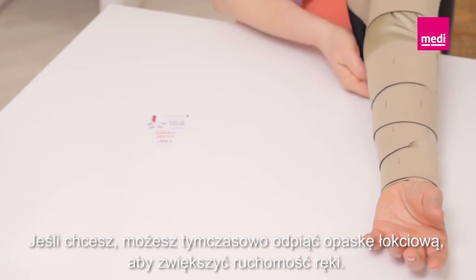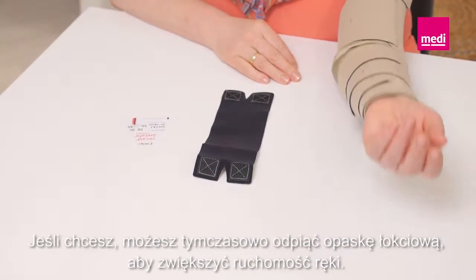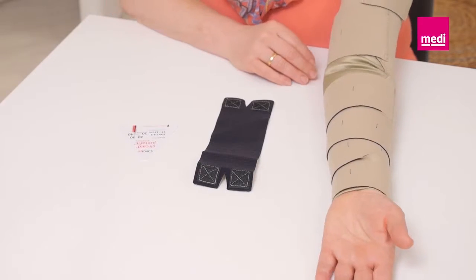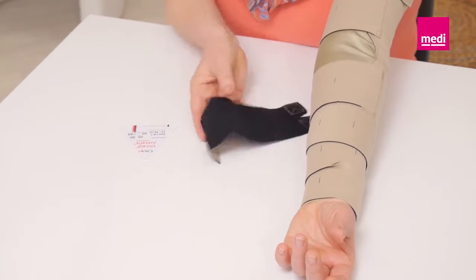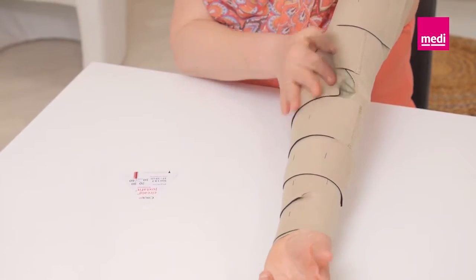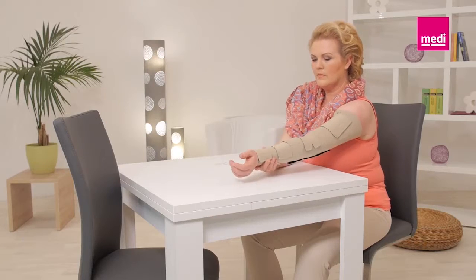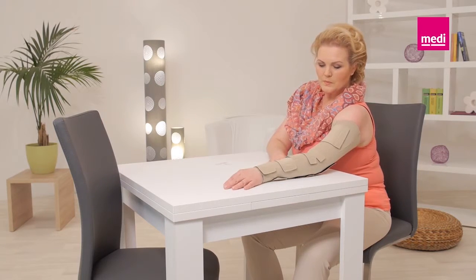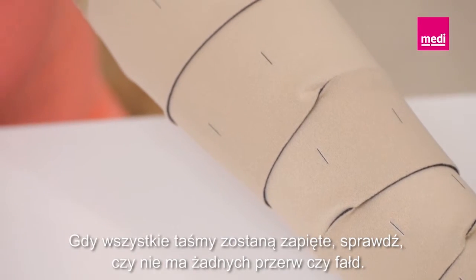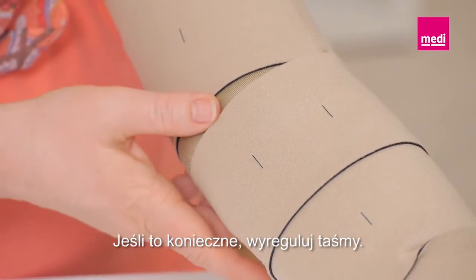If desired, temporarily detach the elbow band in order to increase mobility. Once all bands are secured, inspect the garment for any gaps or creases. Adjust the bands as necessary.